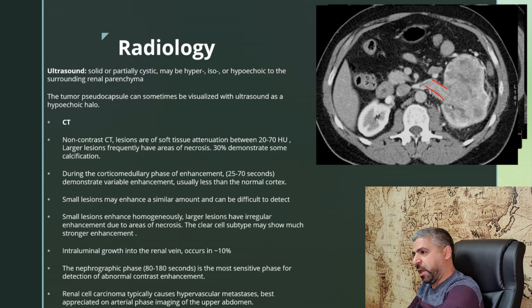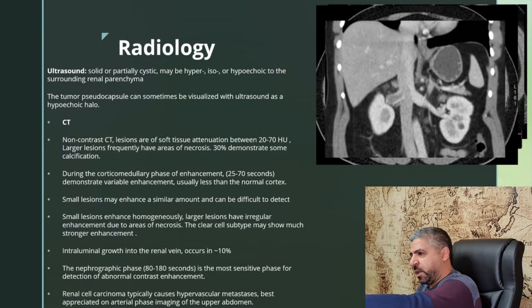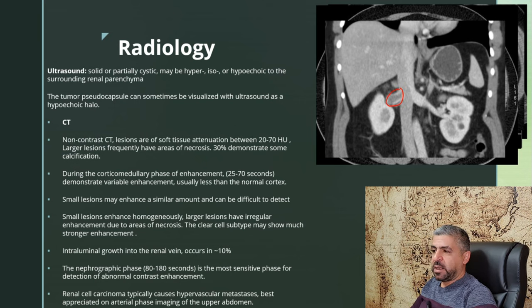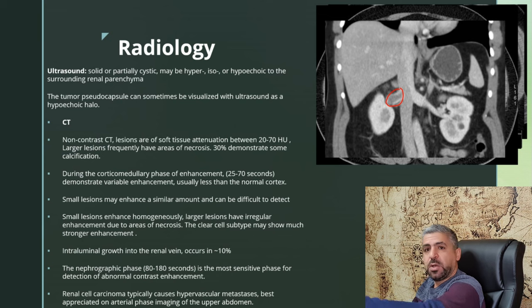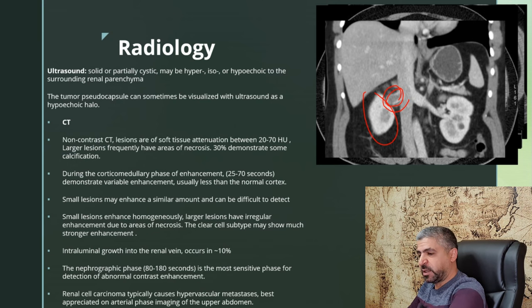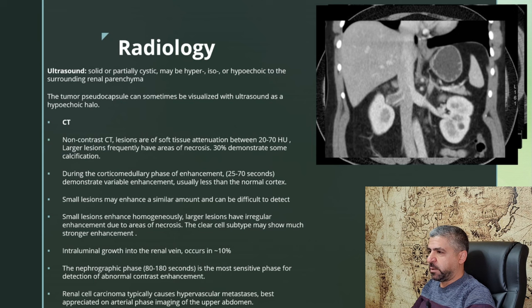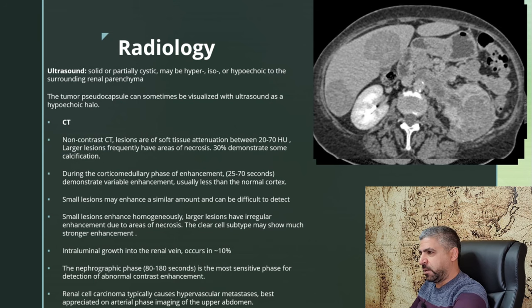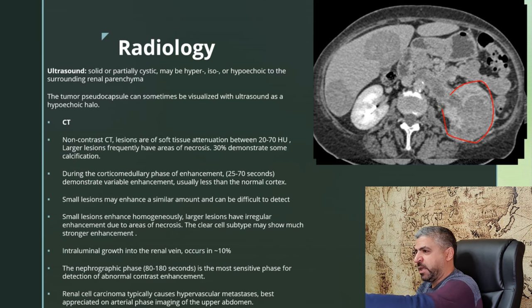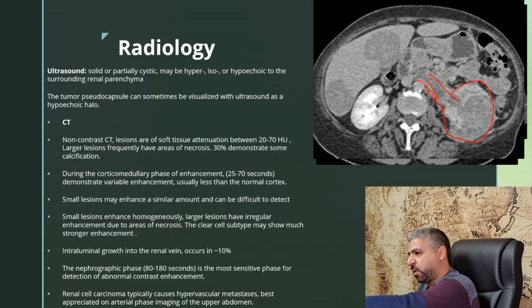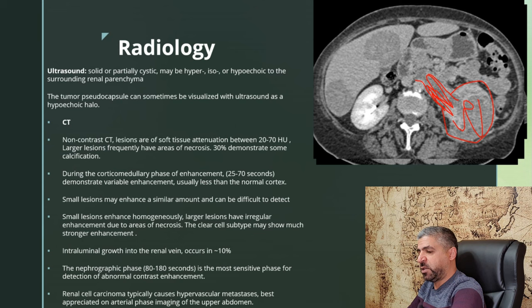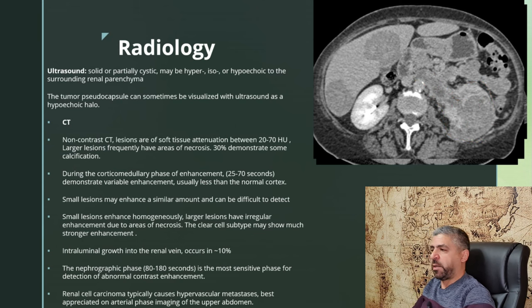Look at this example: there is a filling defect in the right renal vein. Is it enhancing? No — confirming this is a bland thrombus, not a tumor thrombus, and carrying a better prognosis. In another case, a large mass almost replacing the left kidney extends into the renal vein, showing heterogeneous post-contrast enhancement just like the rest of the tumor, confirming tumor thrombus. Additionally, liver lesions visible here are confirmed metastases from renal cell carcinoma.